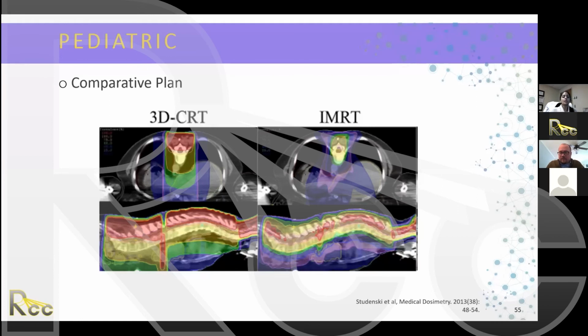So the cochlea can usually tolerate quite a bit. Depending on the scenario, like if I'm treating something in the posterior fossa and the PTV goes into the cochlea, but there's still a little bit of room to spare, I might potentially consider trimming my PTV just a little bit to improve the falloff of the dose for the cochlea. So there are different things you can tweak depending on what the scenario is. But usually you want a cochlea mean less than 30.